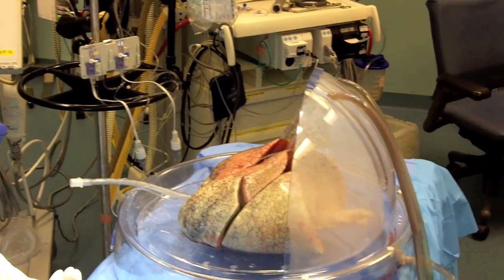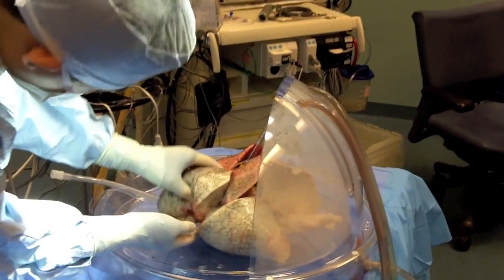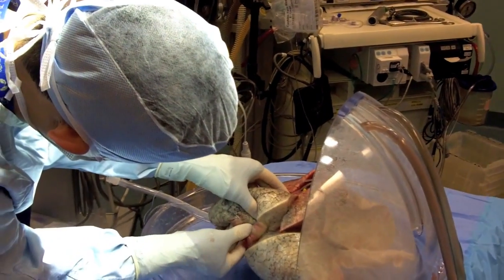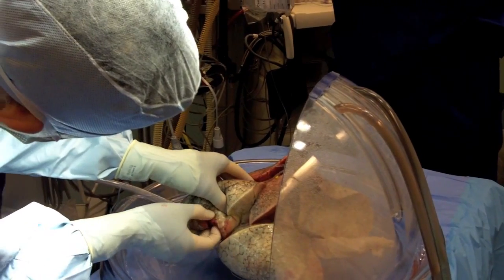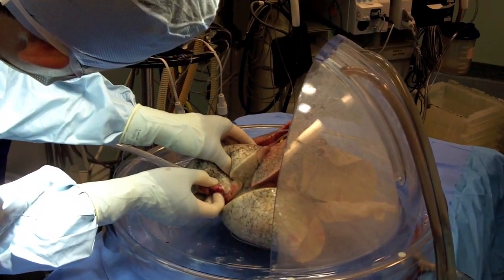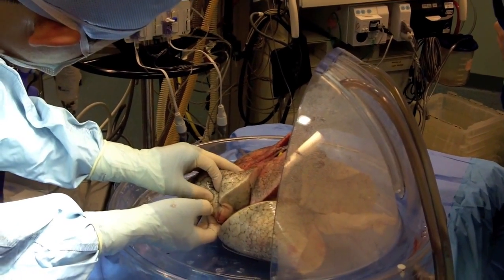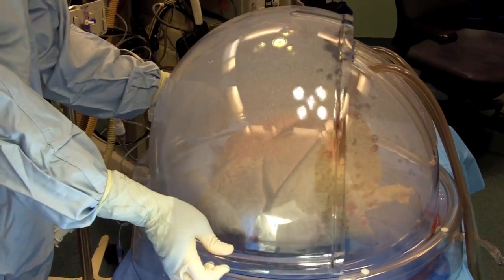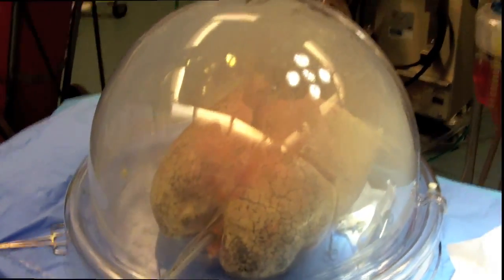The current standard by which we preserve organs for transplantation is to cool them. So you slow down the process to death. However, if you slow everything down, you're also slowing down the ability to recover or the ability to actively repair. So the difference between that strategy and the ex vivo strategy is that in the ex vivo strategy we keep the organ at normal body temperature. So cells can work, they can begin to recover, they can heal, and we can facilitate regeneration.